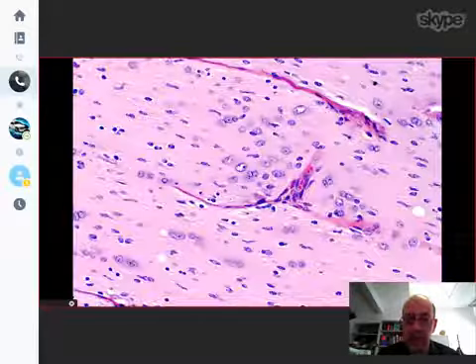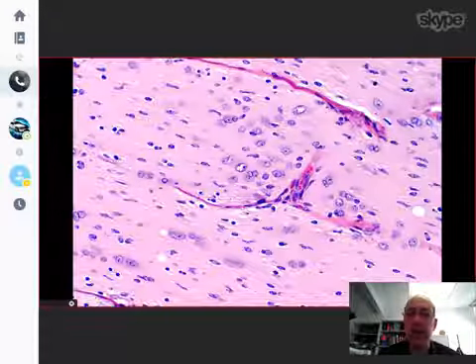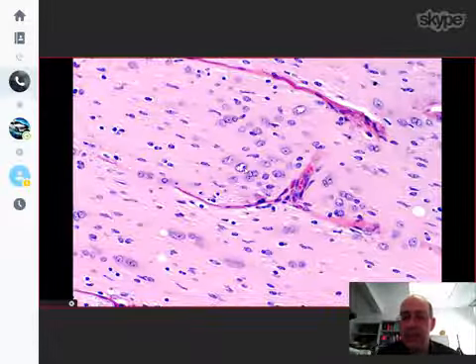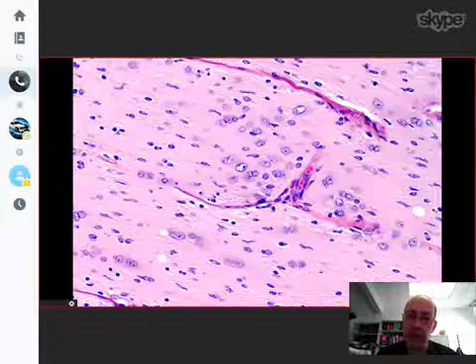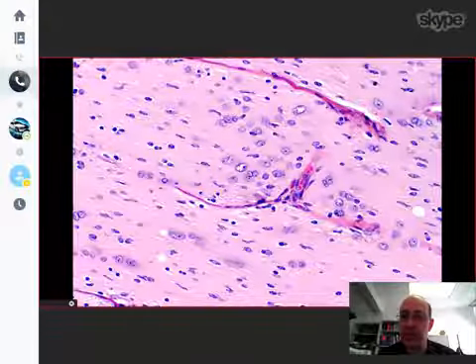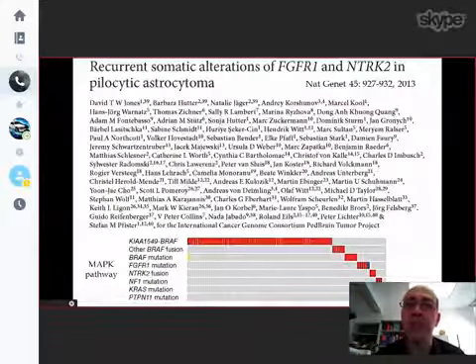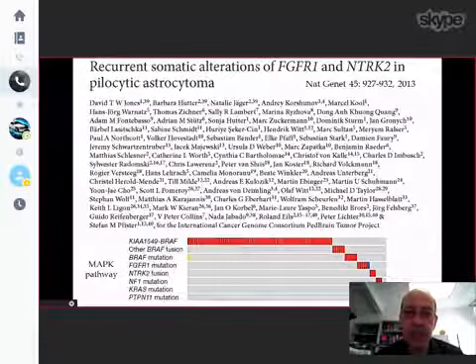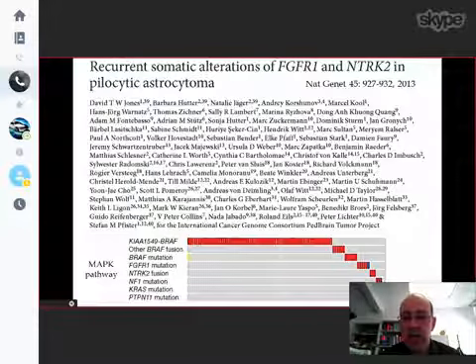And unlike in other locations, these tend to be more infiltrative. So this is optic septi here with a bunch of tumor cells in the middle. It's not as obviously biphasic, and we may not see as many Rosenthal fibers or EGBs. But in a child in the optic pathway, the vast majority of these behave like pilocytic astrocytomas and molecularly are pilocytic astrocytomas.